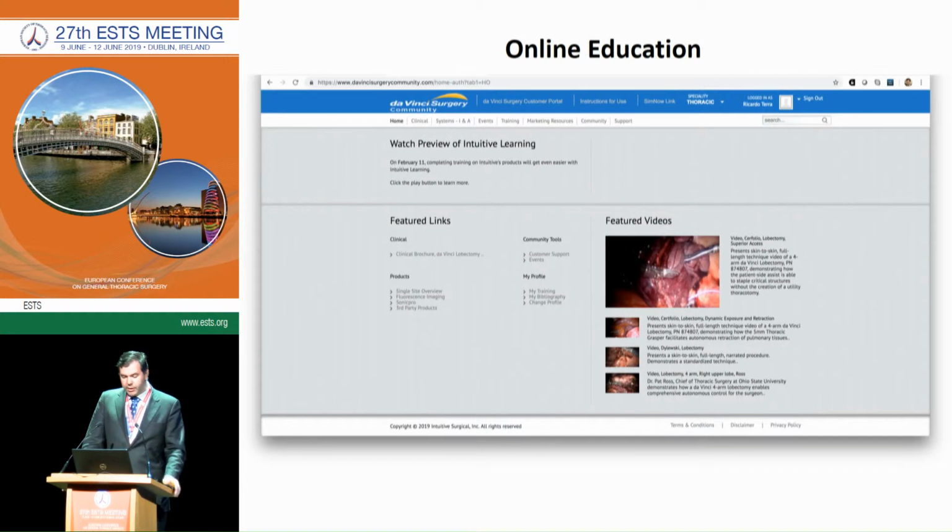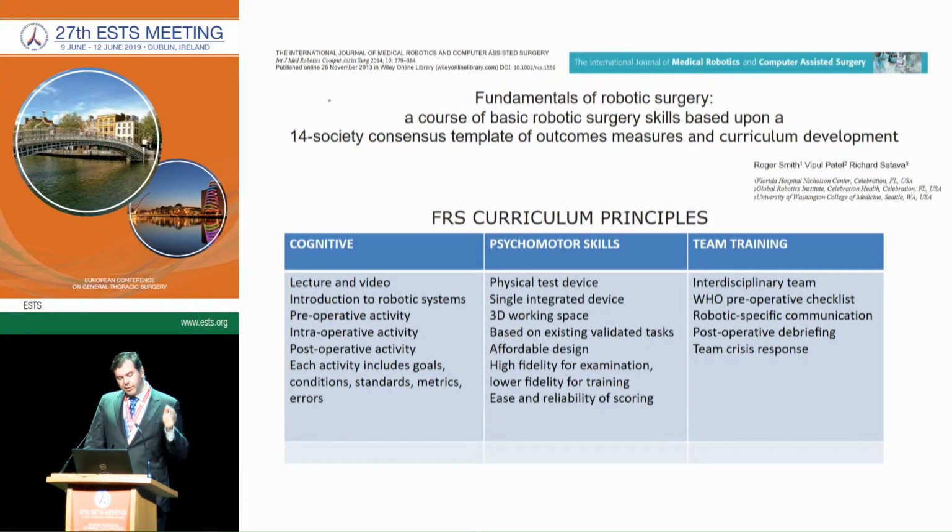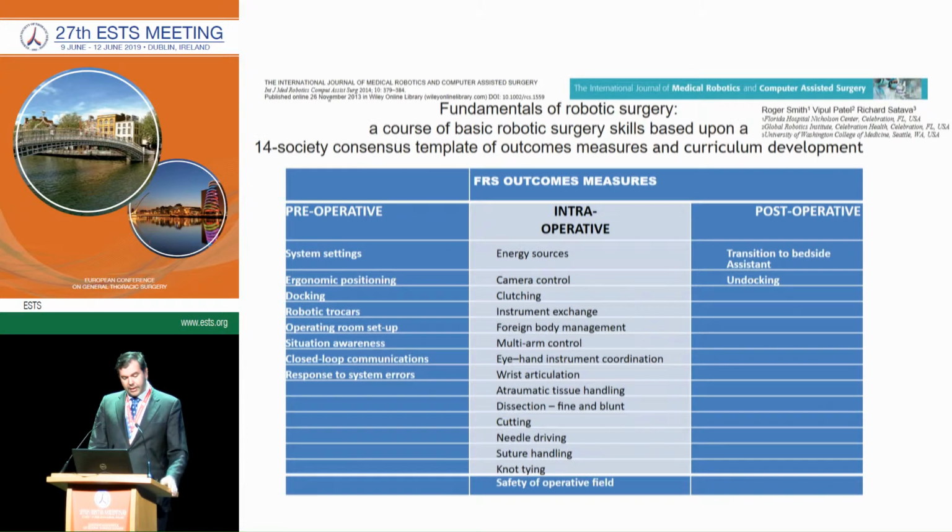You find online education. Intuitive has a very good website for that. And I'd like to highlight this one, the Fundamentals of Robotic Surgery. This is a consensus of 14 societies in which they discussed a lot about how robotic surgery should be taught, and they developed a curriculum based on cognitive skills, psychomotor skills, and team training. Team training is very important because robotic surgery is about playing in a team, so it's a fundamental part of the training. And you find on this website several resources, videos, and exercises that encompass all these points, the cognitive, psychomotor, and team skills.